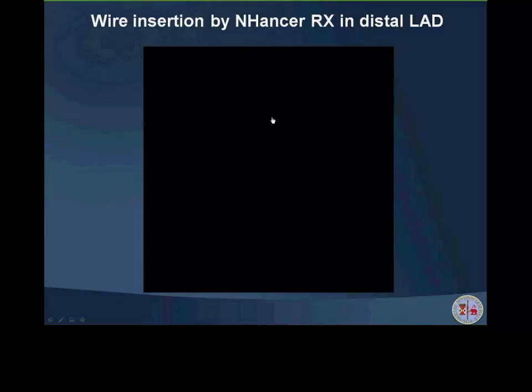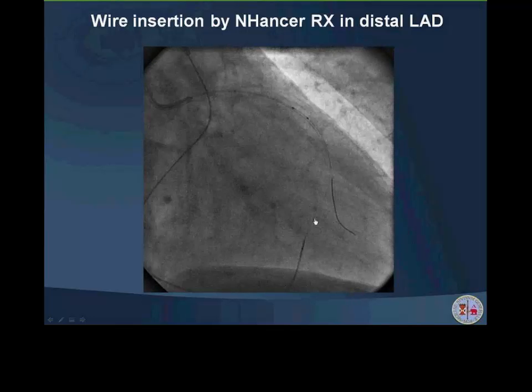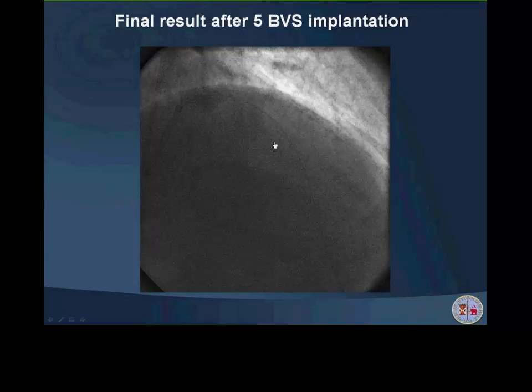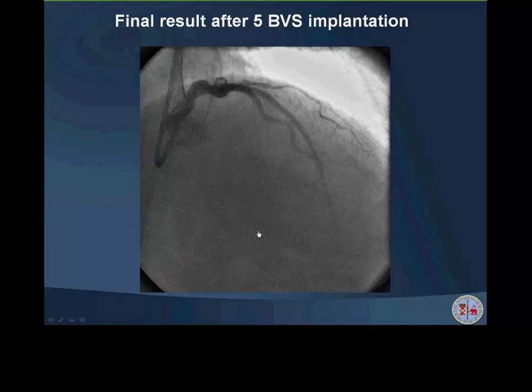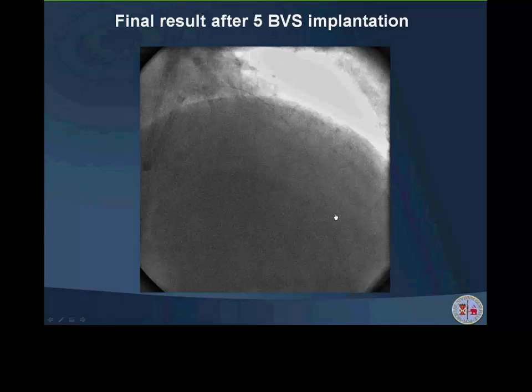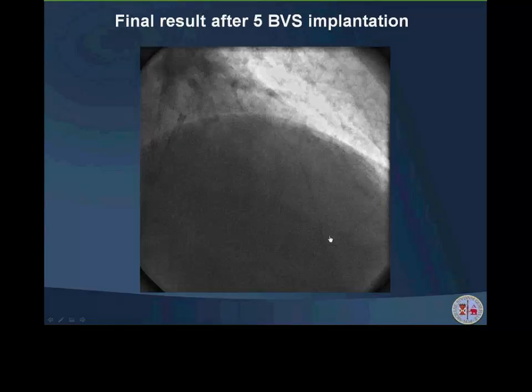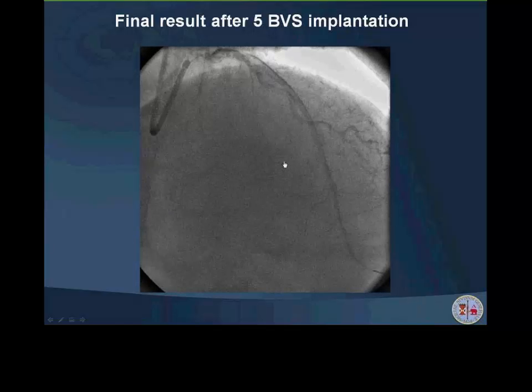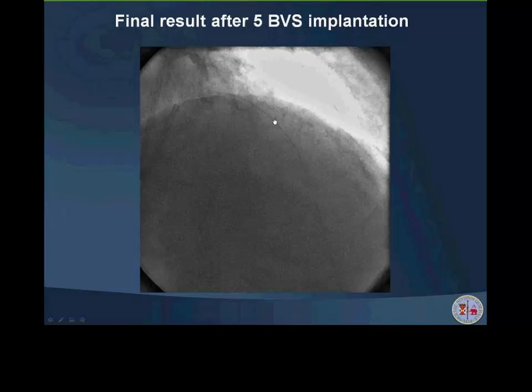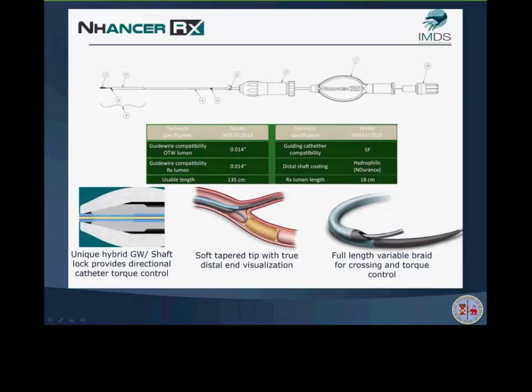I have to tell you that basically the use of the dual lumen catheter in this situation is used many times, and allows you to make sure that the wire, despite entering a very first septal, may allow you to navigate into the more distal LAD part of it. And this is, of course, vital, especially for retrograde septal use, LAD septal use, when the first septal is used. Yes, this is exactly what we were talking about before.